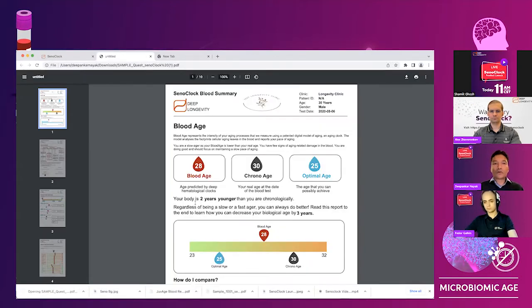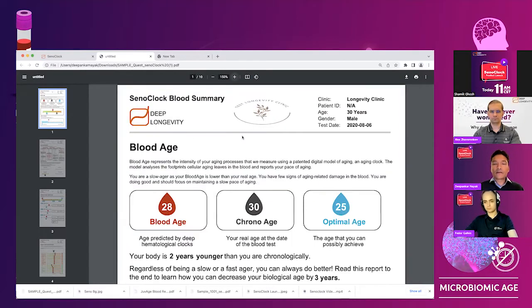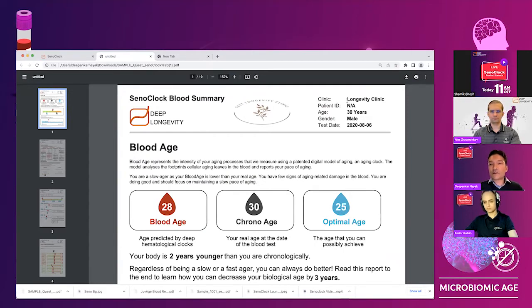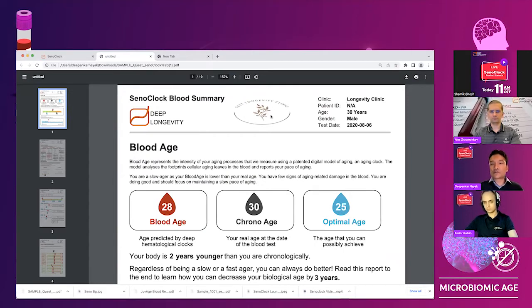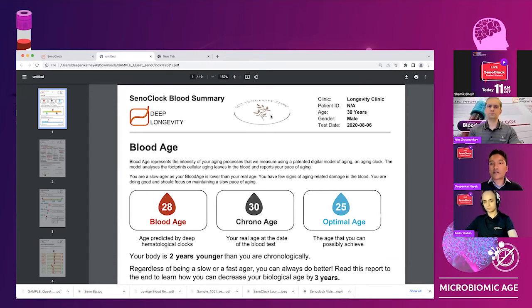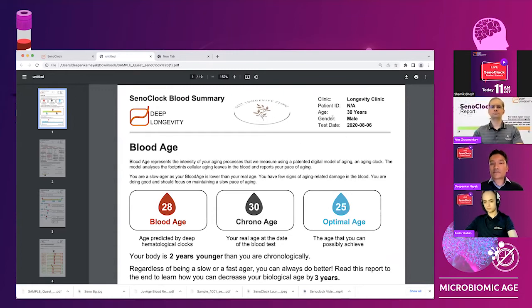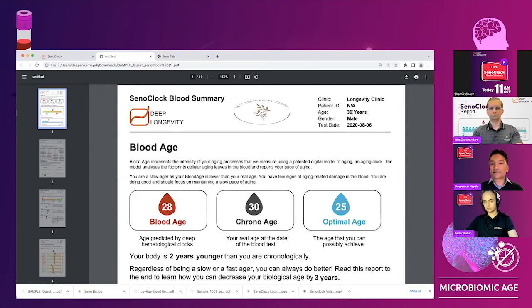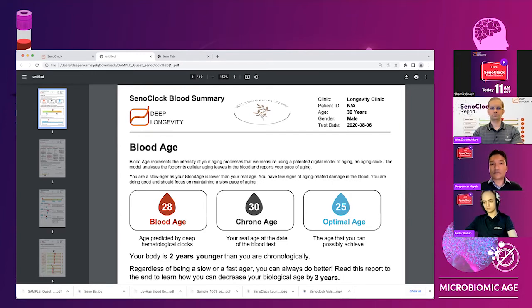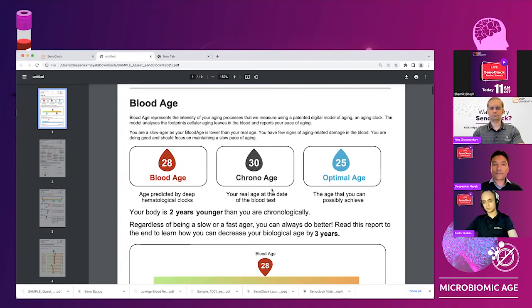So you open the report and this is the Senoclock blood summary. At the top, you can see you have your clinic name. This is a test logo. So this would be the logo that your organization would have. So this would be like a branded offering from your organization that would be shared. The information about the user is listed here. This is just the patient gender and age. And that's actually all we need to generate these reports.